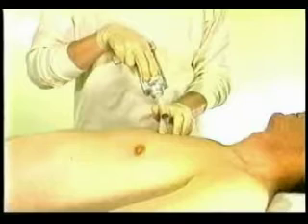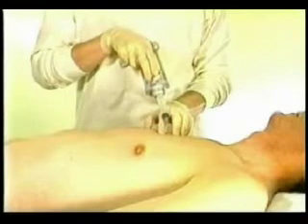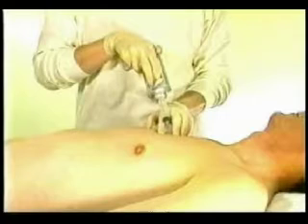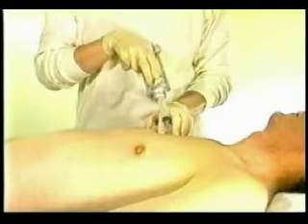I support the syringe with my thumb like this. Another possibility is to simply lean the syringe on my forefinger. The needle will enter the skin at an angle. Because of this, I will penetrate the skin a little below the mass so that the needle tip is hitting straight for the center of it.